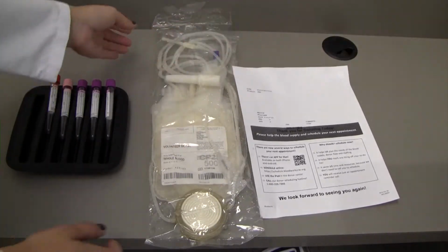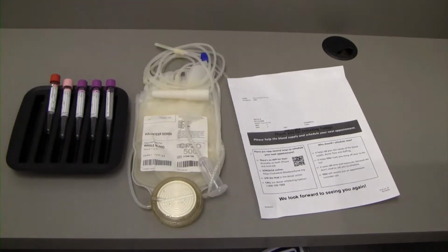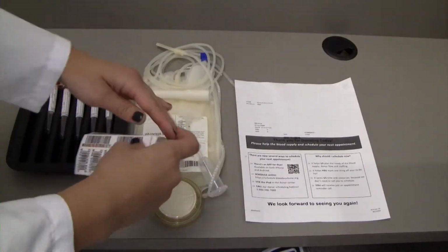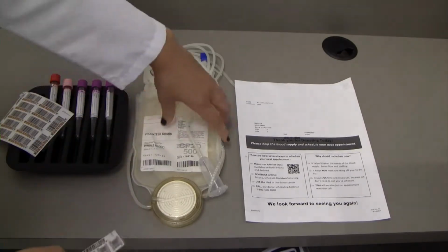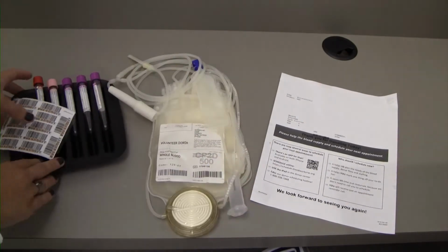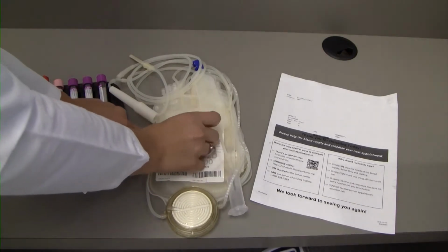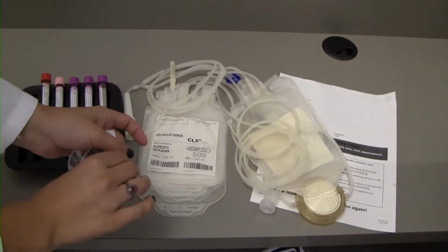Select collection bag for intended type of collection according to the bag order. Label collection set and tubes. Apply small portion of the DIN sticker set to the back of the red cell bag. Apply large DIN sticker to the collection bag. Apply large DIN sticker to the satellite and red cell storage bags.